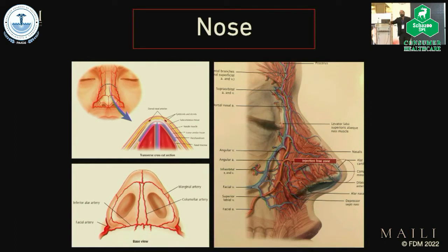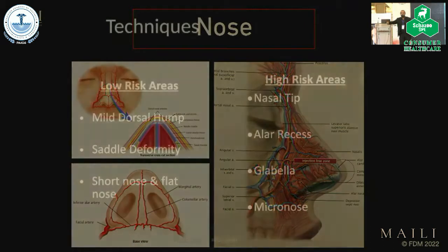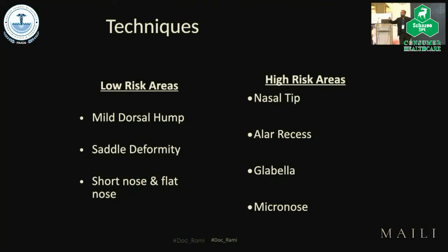But what you find is, in most patients who require any alteration to their nose, what they usually want is to reduce the volume of the nose. They want a smaller nose. Remember, when you're placing filler, you're adding volume to the nose as a whole, so it's going to look bigger. What we're doing is camouflaging: hiding the hump by adding filler behind it and in front of it to make it very straight. That's as far as hyaluronic acid goes for non-surgical rhinoplasty.